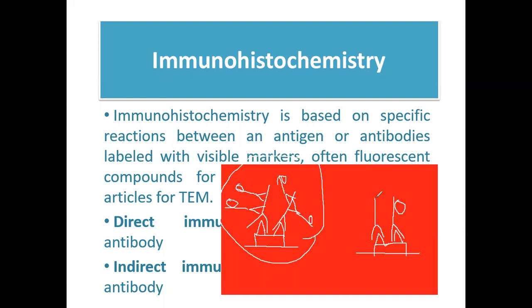Okay? So, imaginein mo yung two signals na binibigay nitong direct technique mo compared dito sa four. Four na signals na binibigay ng indirect technique. Okay? So, anong ibig sabihin nun, guys? Your indirect technique, okay? Indirect. This is your indirect and this is your direct. Your indirect technique is highly sensitive, okay? Compared to your direct technique.